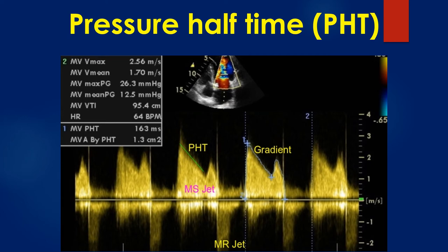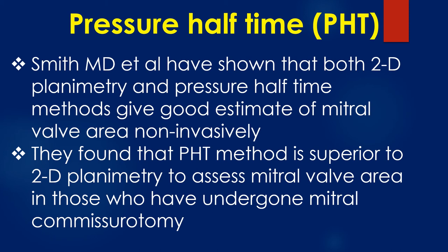In this image, the green cursor measures the pressure half-time of the mitral stenosis jet. In this case, the pressure half-time was 163 ms and the estimated mitral valve area by pressure half-time was 1.3 cm². Smith and colleagues have shown that both two-dimensional planimetry and the pressure half-time method give good non-invasive estimates of mitral valve area. They found that the pressure half-time method is superior to two-dimensional planimetry in those who have undergone mitral commissurotomy.